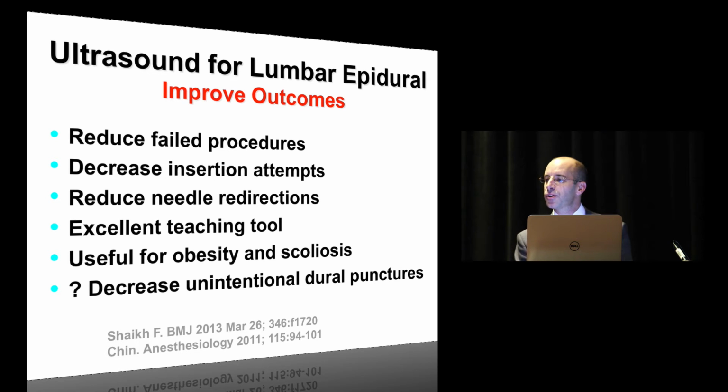I know the money shot will be showing a decreased dural puncture. I don't think we'll ever see that for various reasons, but I think that may be the ultimate one that will lead to change of practice.